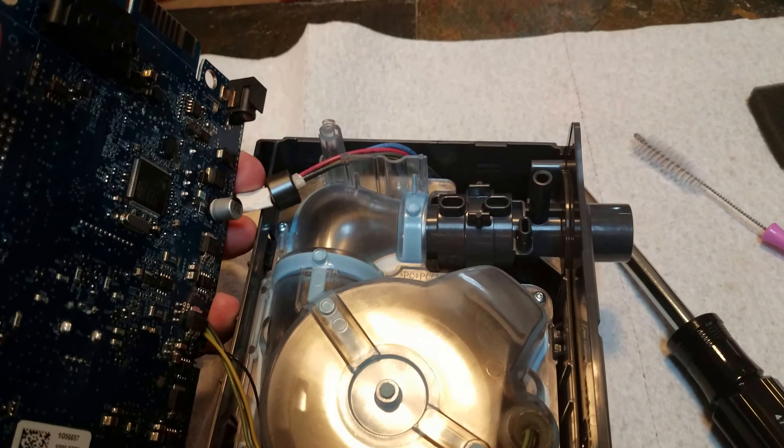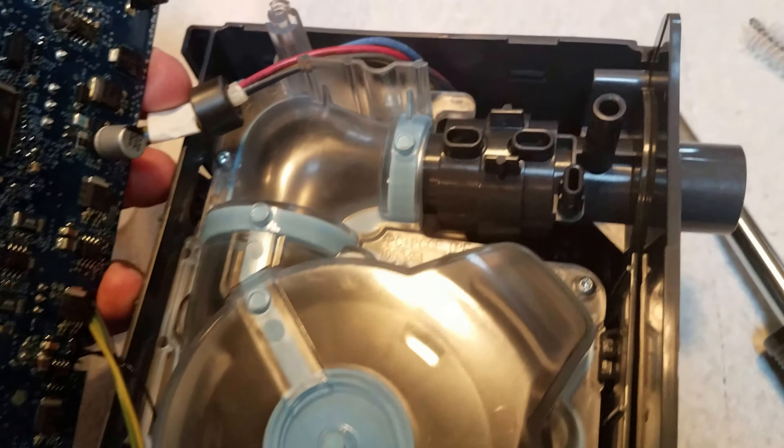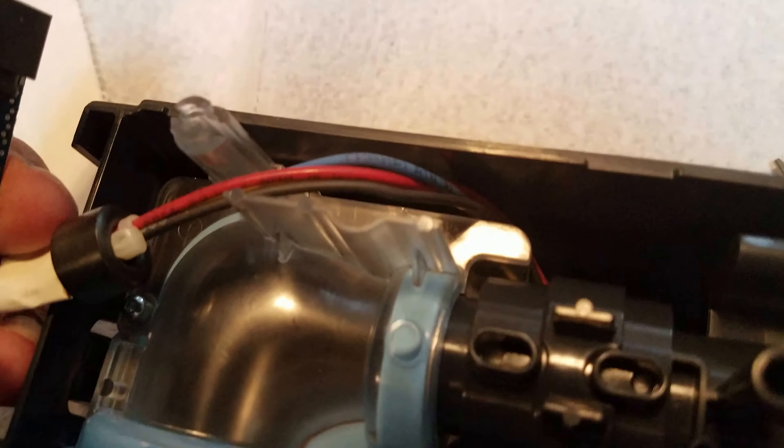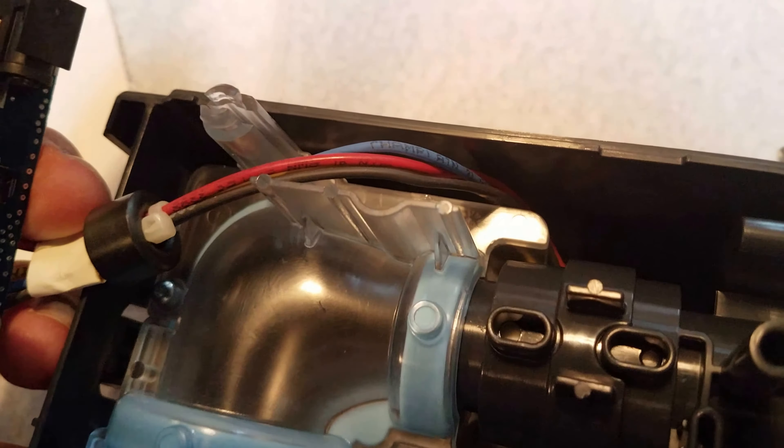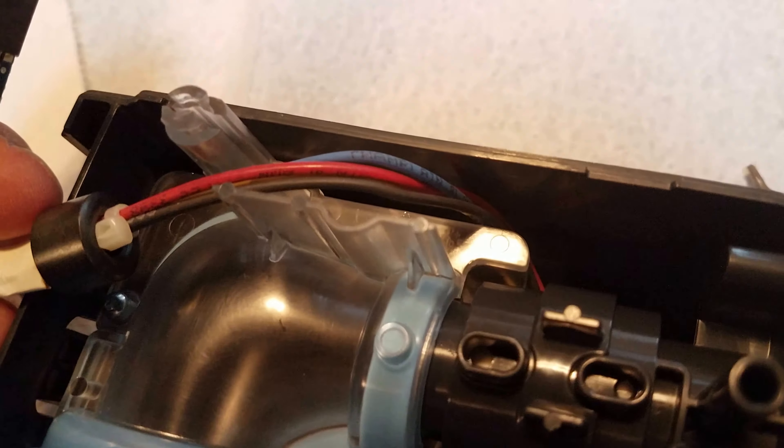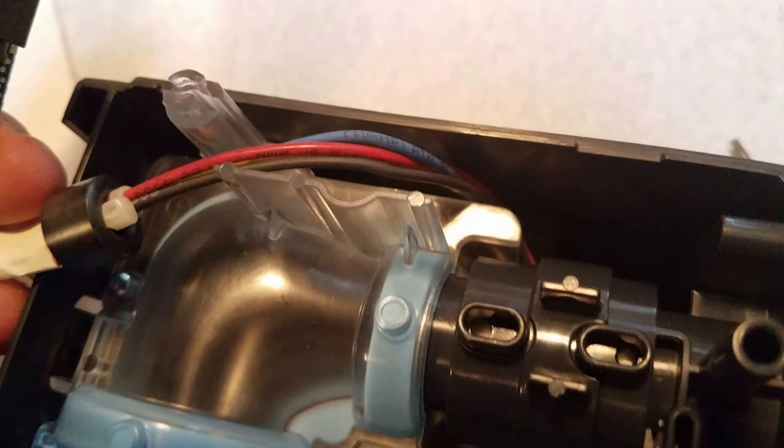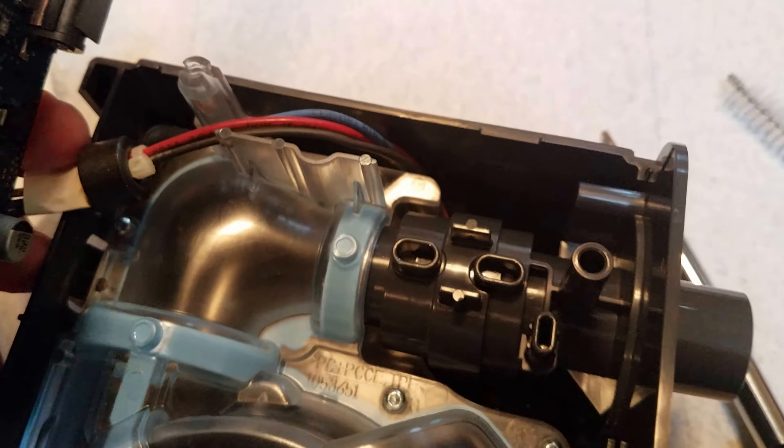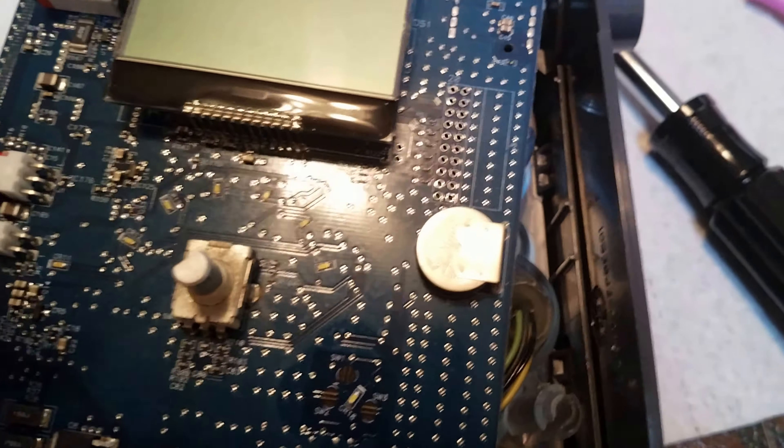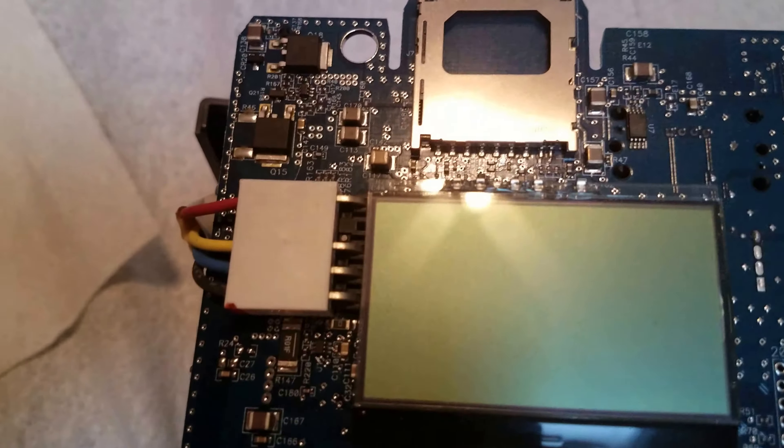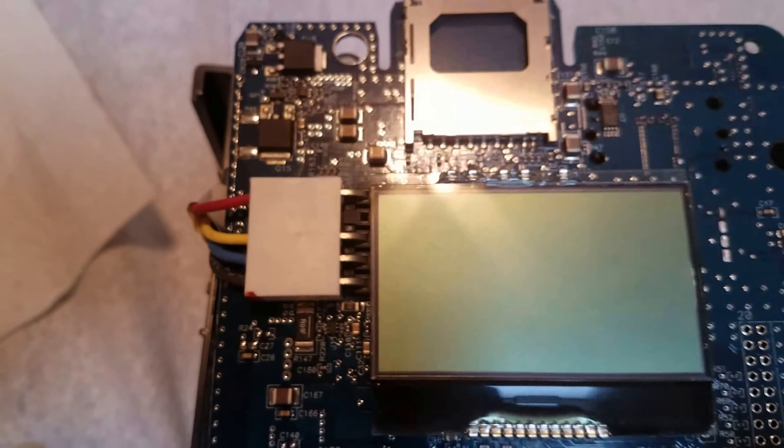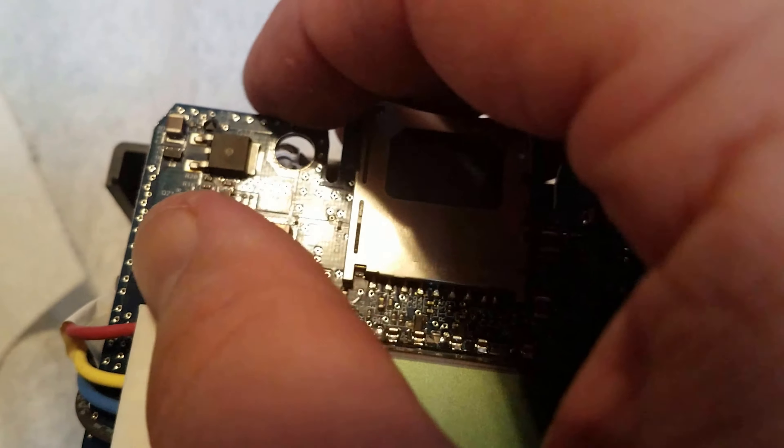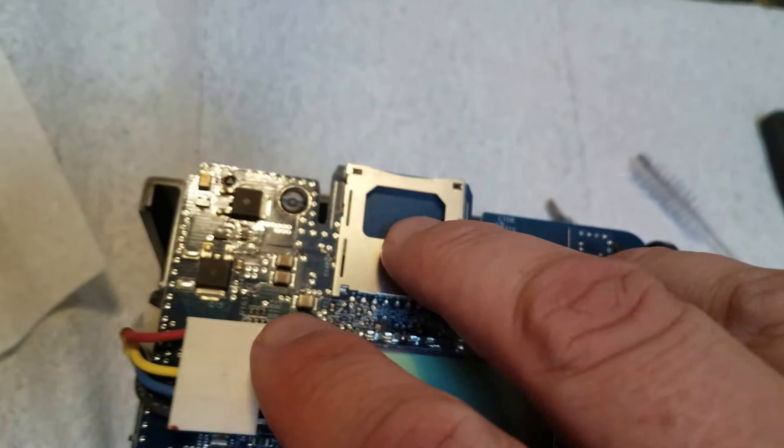Once again, this wire tucks in. These red, blue, and black wires you see here, and a little bit of yellow in there too, tuck in between those two plastic pieces there. Make sure you have them like that, otherwise it won't clip down properly. I've got these connected properly, got that one in. I'll push this back together. That clipped in and that clips in.